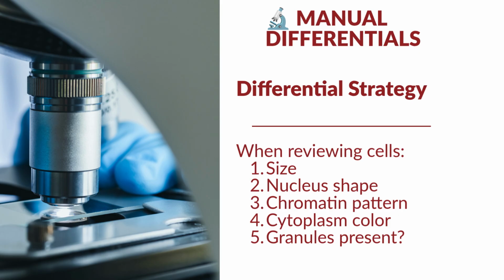Almost done, guys. So, automated versus manual differentials. Manual differentials indicate when immature cells are present, blast flags, abnormal scatter plot, instrument flag. So when you're getting a flag, don't ignore it. Go on and make that diff. It's not going to take you but a couple of seconds.